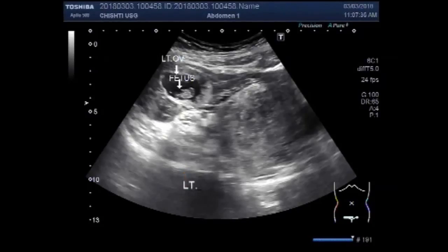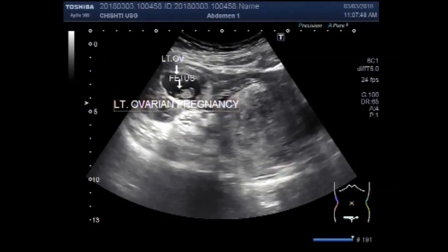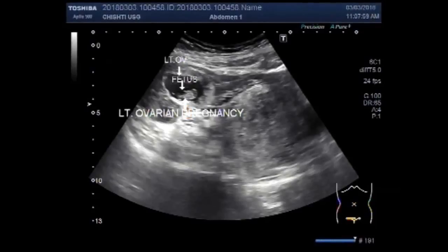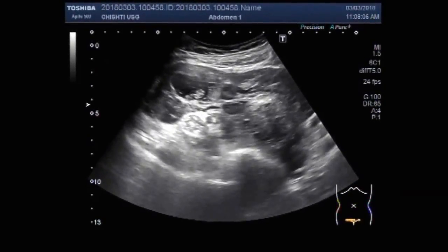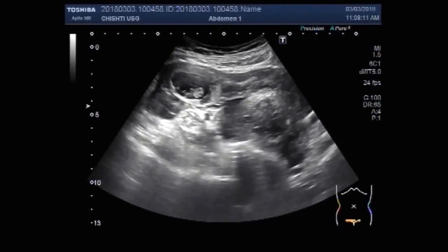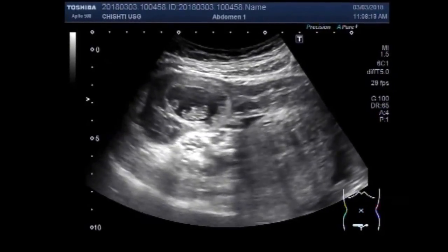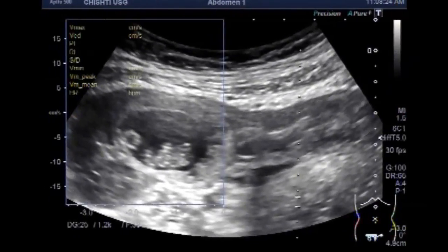This is extra-uterine pregnancy, twin pregnancy — left ovary pregnancy. You can see the fetal cardiac activity, which is visible and also audible.